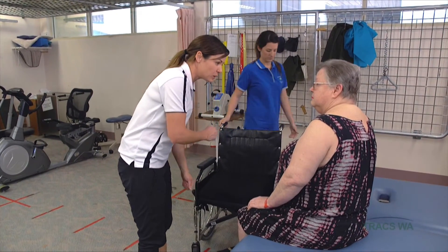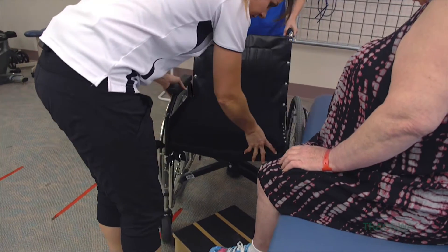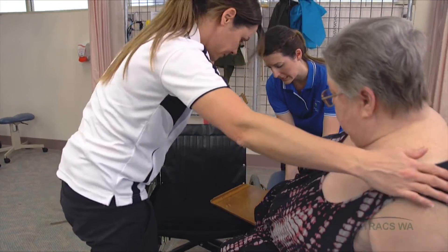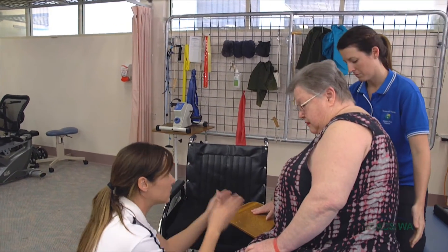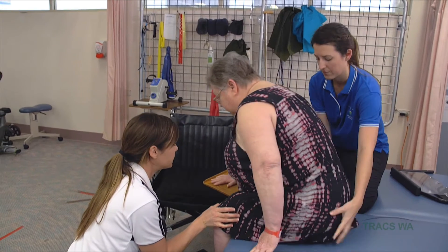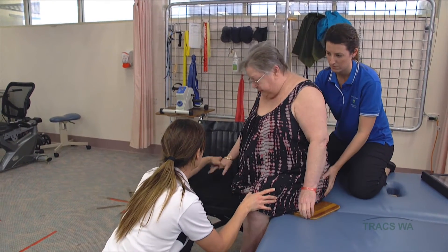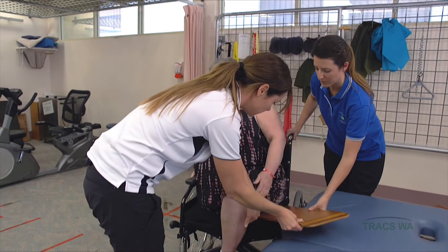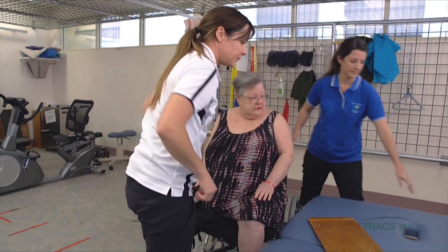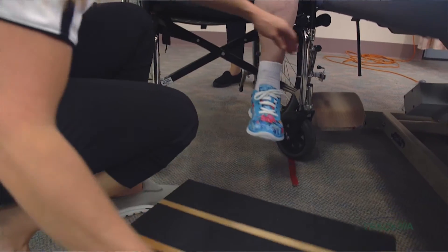We're going to get back into the wheelchair from the plinth. Let's pop this armrest off, brakes on, and we'll just pop the slide board underneath the leg. I'm going to help you with your leg again, and Bridget's going to help you with your bottom so that you don't slide across the board. Push through both hands and lift your bottom up and over across the board onto the wheelchair. Try and support yourself with your hands. Lean across and take that slide board out. Grab the armrest — we'll take this box away and give you back your foot plate.